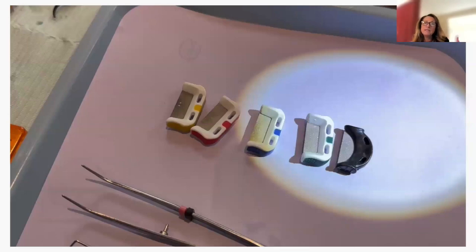And I know Dr. Whitman, instead of on her delivery date, they don't place attachments. They send their patient with aligner 1, so the patient gets used to taking it in and out and gets used to wearing that aligner 1. So she wore it for a week, then they brought her back and then placed the attachments. So that's more for patient comfort.